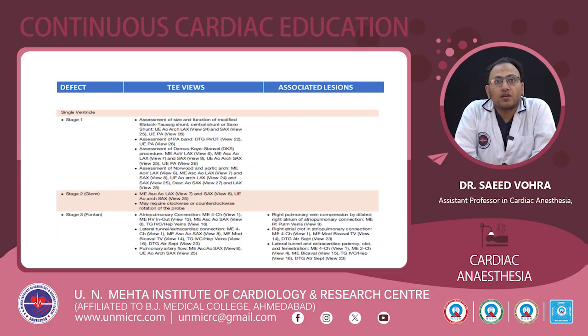In patients with Fontan, the atriopulmonary connection can be seen in the mid-esophageal RV inflow view, the mid-esophageal ascending aorta short axis view and the transgastric IVC hepatic vein views. The lateral tunnel or the extracardiac connection can be seen in the transgastric IVC or hepatic vein views and bicaval tricuspid valve view. Pulmonary artery flow can be seen in the mid-esophageal ascending aorta short axis view and upper esophageal aortic arch short axis view. If right pulmonary vein compression is suspected, it can be seen in the mid-esophageal right pulmonary vein view.